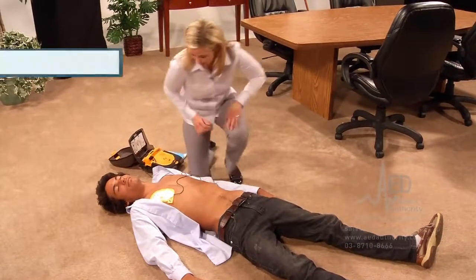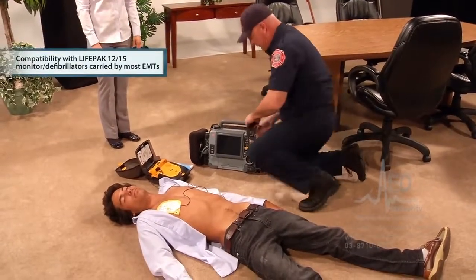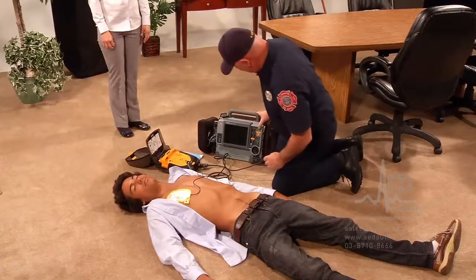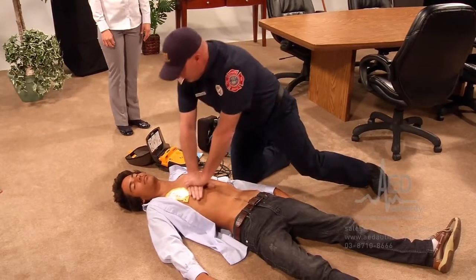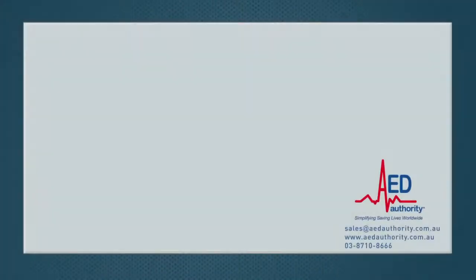Transferring the patient to the local emergency medical team has never been easier. Simply unplug the CR Plus pads and plug them into the LifePak 15. Because of the LifePak compatibility, time is saved and it ensures continuity of care by continuous collection of patient data.